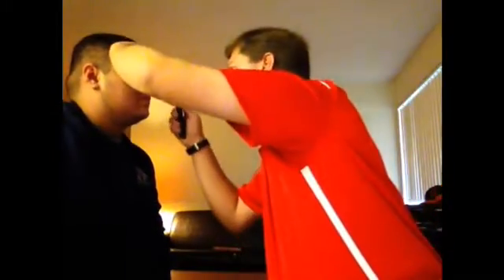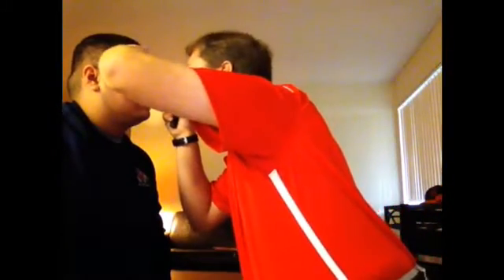So we're going to have to get close up with the patient, look through. We're going to check both eyes, and we're just kind of looking at the iris to see if there's any deformities, like I said, like any lacerations or things like that that are more superficial to the eye. So go ahead and cover there. Go ahead and open the eye.